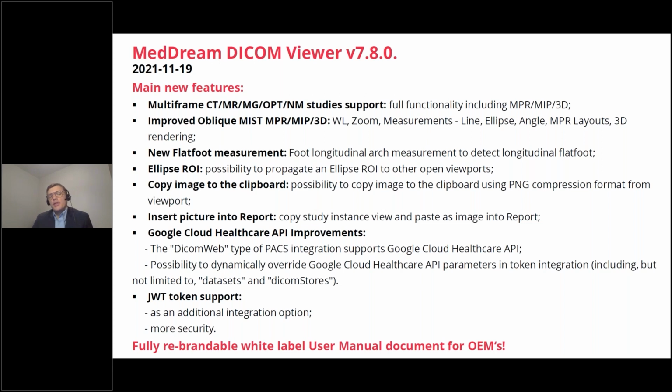Another very nice feature is for the Google Cloud users. We also implemented an improvement in the speed of DICOMweb performance, and we changed parameters which now allow users to set security features on the Google Cloud. So now our product is even more usable on the Google Cloud Healthcare.